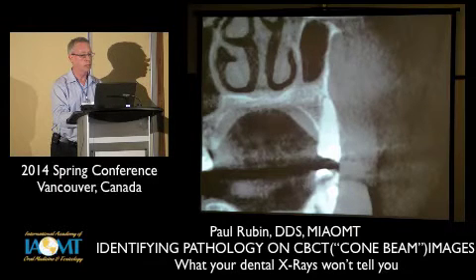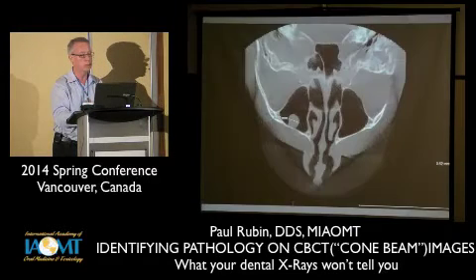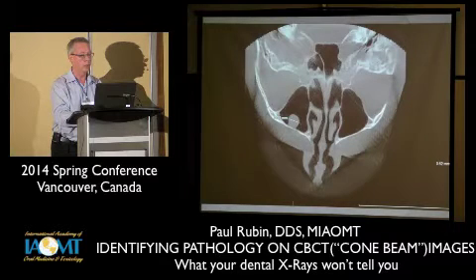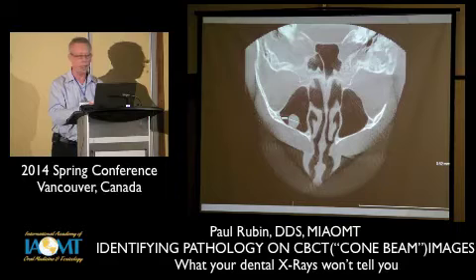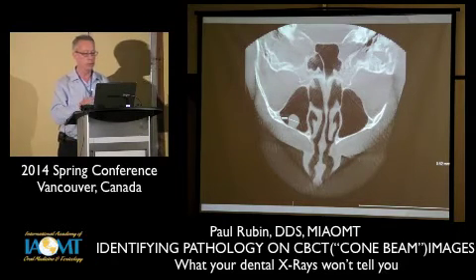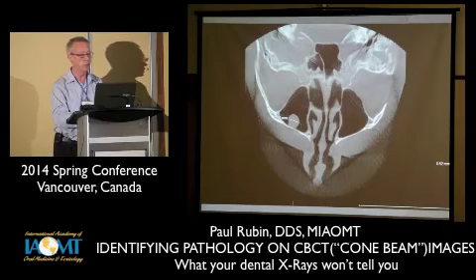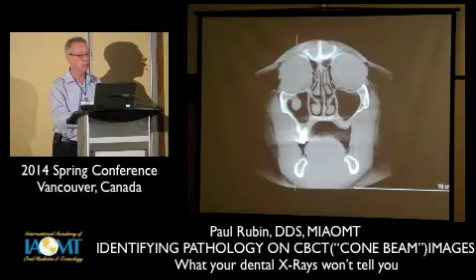On this same patient, when we did the scan on the radiology view, remember I showed you that different kind of view? Here's what we saw in her sinus. On her right maxillary sinus, there's this nice little round thing that looks like a balloon here. This is a typical look of a sinus polyp. Another thing you can do on these images is measure this, so you have information that you can send if you wanted to refer her to an ENT doctor.